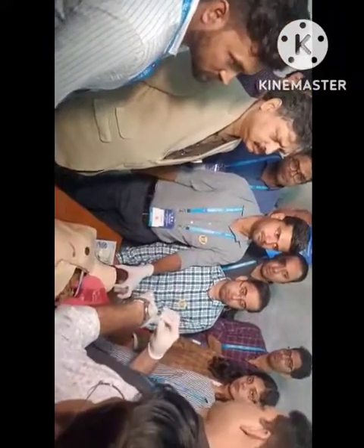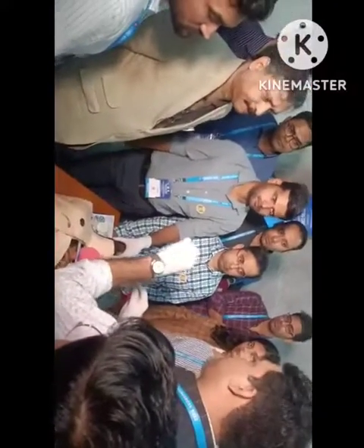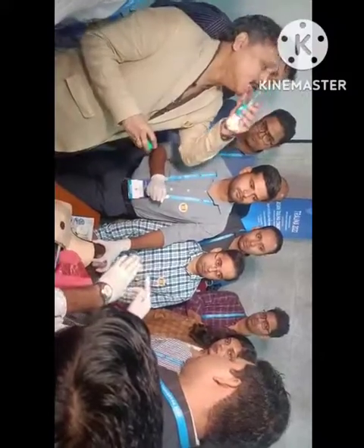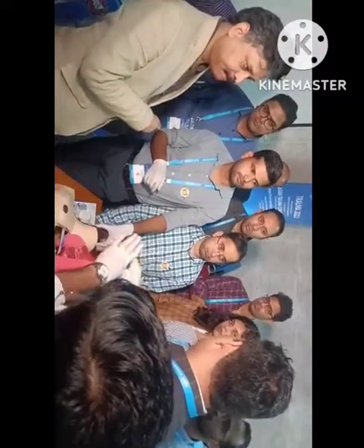Then there are three structures: the esophagus with the NG tube, which you can feel by palpating between finger and thumb, and then the spine. Between them there is a fascia covering both. You just dissect between both of them with your finger. Blunt dissection, right, blunt dissection by finger.